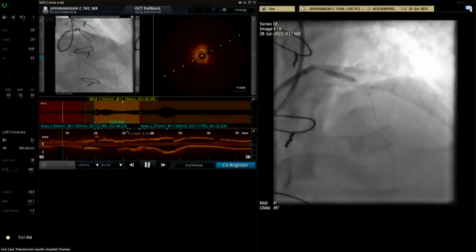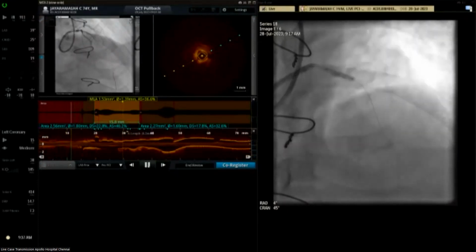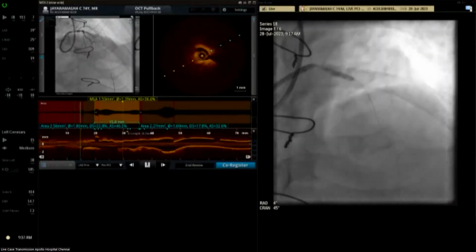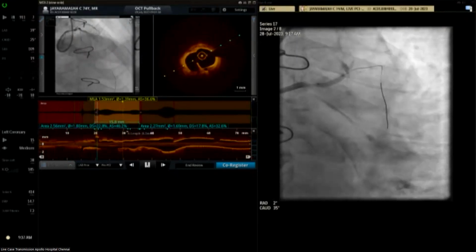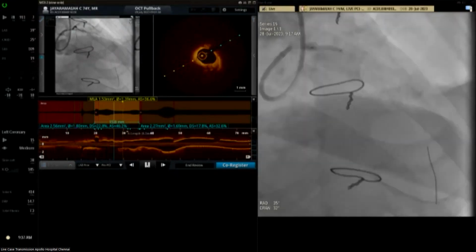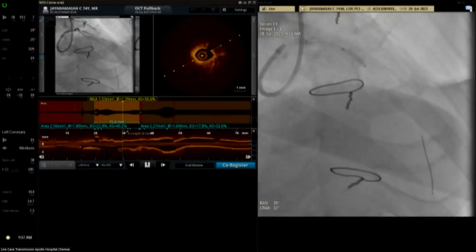If you look at the cutting balloon usage in both the arms, not just one arm, both the provisional and the 2-stent arms, the patients' ages are around mid 70s. Patients are not very young, and you can see they mentioned moderate calcification, severe calcification. There's a decent amount, around 60% had at least moderate calcification. But if you look at the supplementary and look at how much cutting balloon use there was.